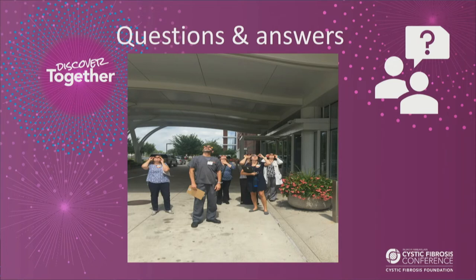We definitely didn't keep track of what were categorized as acceptable tests. When we get on the dashboard, we look at the entire series, and we reject tests that don't have good quality. And I think a lot of that has to do with experience and coaching of the patients. Some of our patients are 8 or 9 years old, so coaching in clinic is a big thing. So if we saw poor quality testing that we knew was not going to be usable, we would reach out.